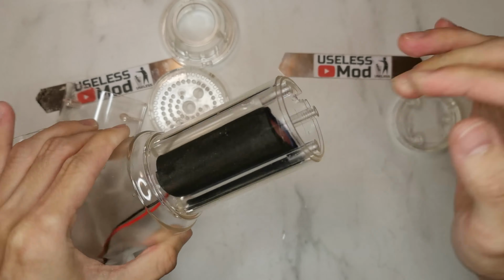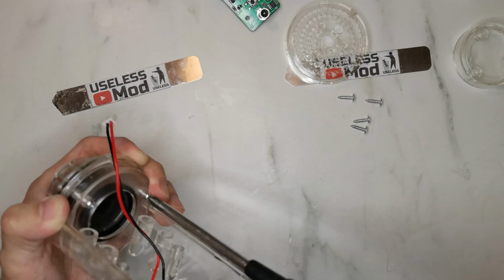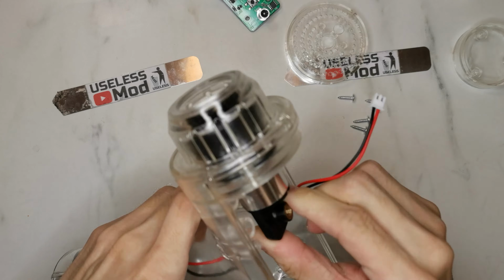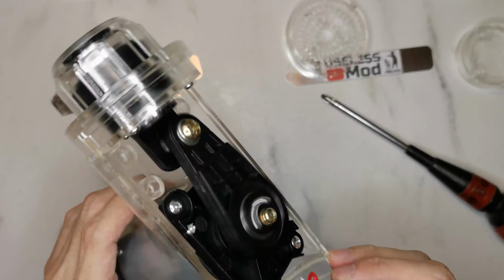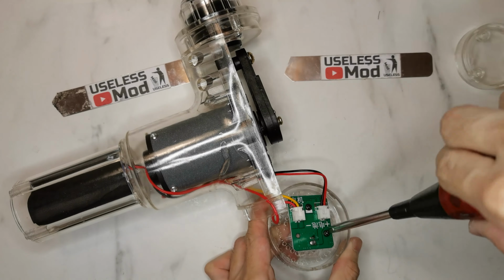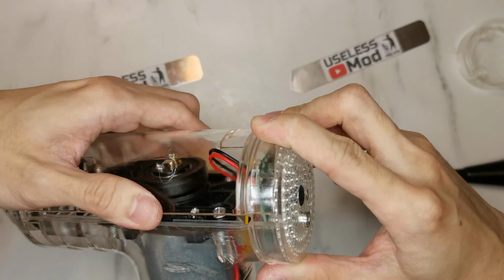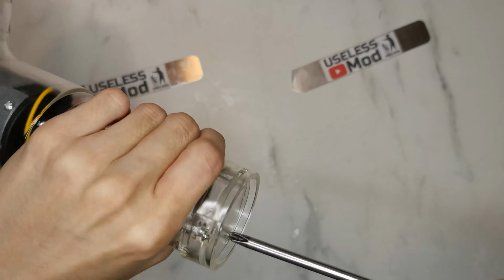First, the battery. Push the bushing back to the front case. Screw it back. Put the shaft back to the bushing. And then the motor. Put back the screw. Test everything's working. Secure the motherboard. Put the rear cap back and the screw. And finally the bottom cap.